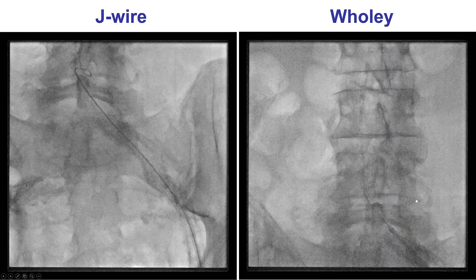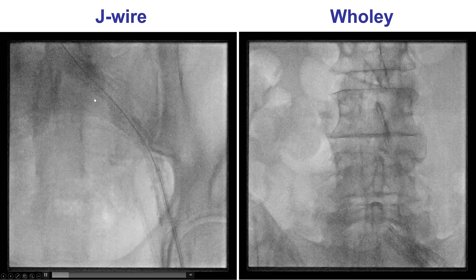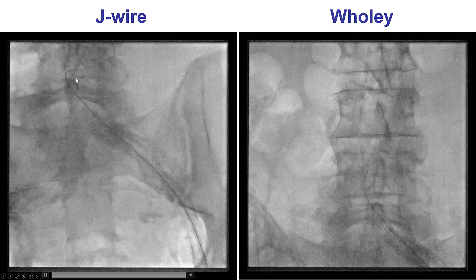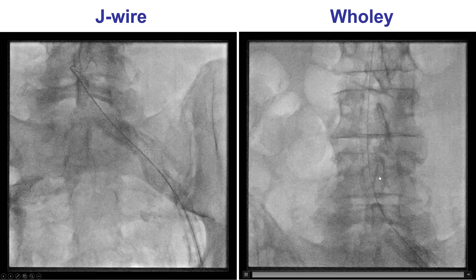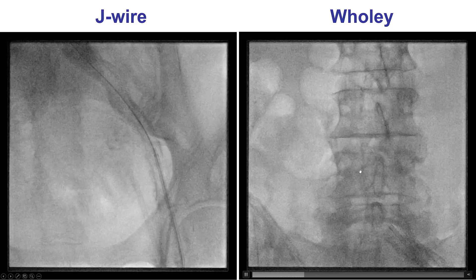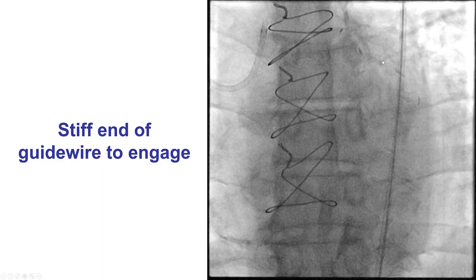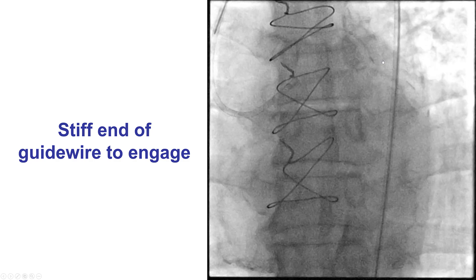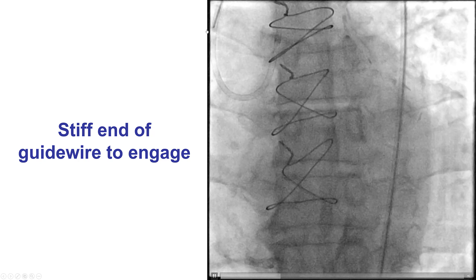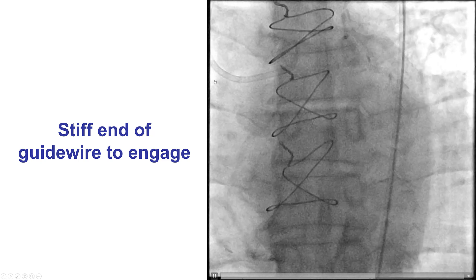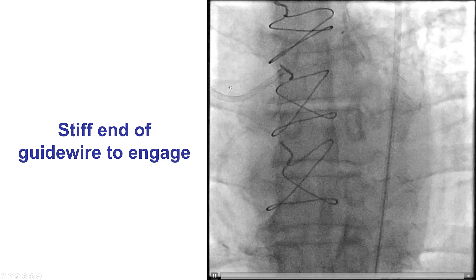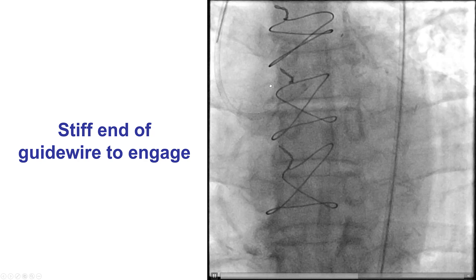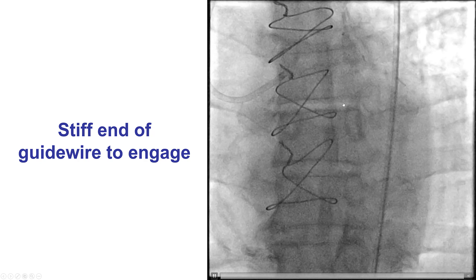We then had significant difficulty getting past the distal aorta, likely due to significant disease and calcium. So we used the Wholey wire, which has a very soft tip, and that went up into the aorta. Engaging was also challenging. However, we were finally able to advance the back end of the stiff Kite wire to straighten out the EBU guide, and then the guide was able to engage the left main.